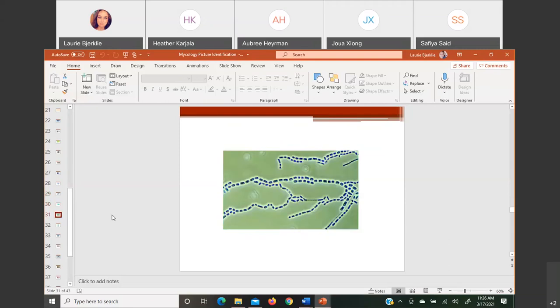Oh, finally. Okay. People are going to guess Coccidioides on this. It is not. It's very similar looking to Coccidioides. This is a new one that I added in. And I knew somebody would have this out of the microbiology section. It is Geotrichum. It is another opportunistic fungi, so same category as Alternaria, Penicillium, Fusarium, opportunistic, so Geotrichum.